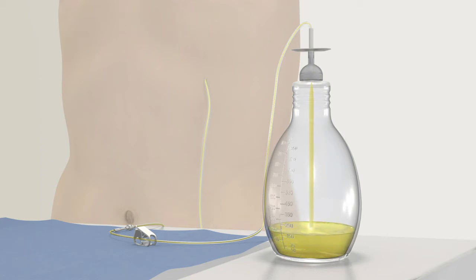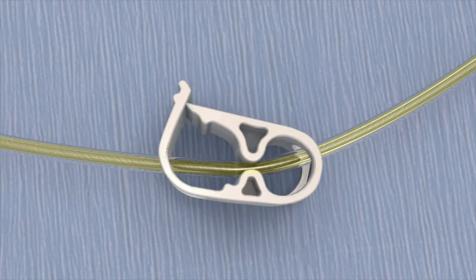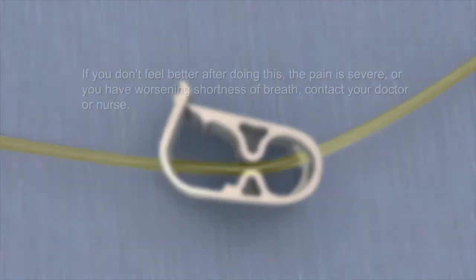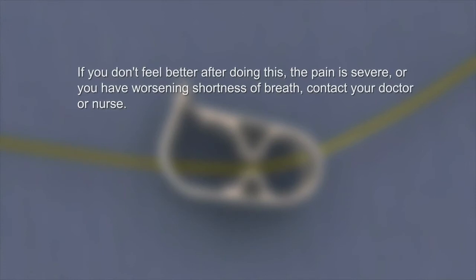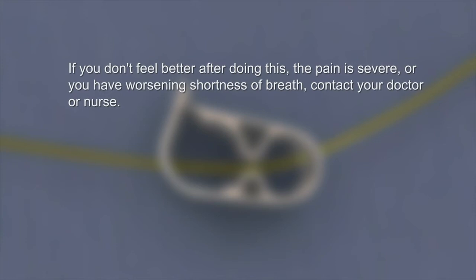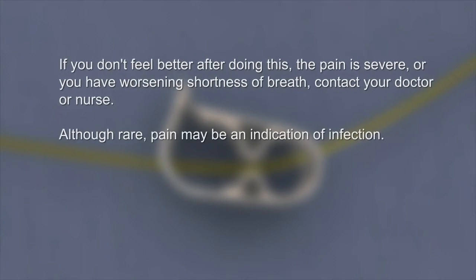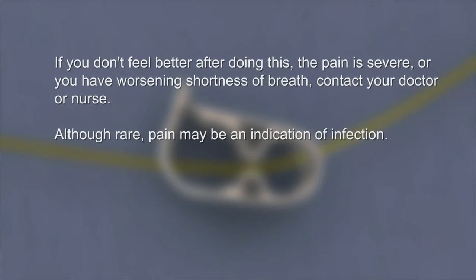It is normal to feel some discomfort, pain, or even coughing when draining fluid. If you do experience discomfort or pain when draining, clamp the drainage line to slow or stop the flow of fluid for a few minutes. If you don't feel better after doing this, the pain is severe, or you have worsening shortness of breath, contact your doctor or nurse. Although rare, pain may be an indication of infection.